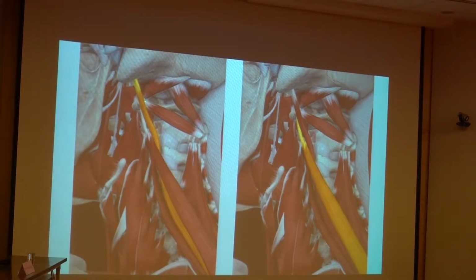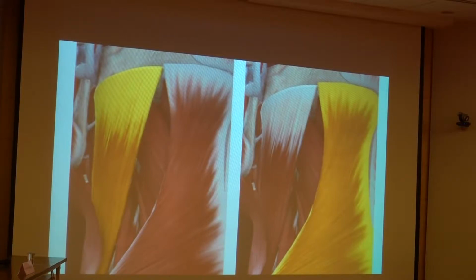So when you scan the long axis of your obliquus capitis inferior, you're going to see on top of it your longissimus capitis. And also when you're scanning the C2-3 facet, you're going to see that the splenius capitis is really covering that, on top of the third occipital nerve. So that's the muscle we frequently forget. In fact, you're seeing it when you're trying to do the intervention on the third occipital nerve or the C2-3 facet. You are doing the injection all the way through that muscle, and that muscle is not small, it's big as well. And then also another landmark, you probably see it, but you don't know it. It's the most superficial layer of the muscle, the upper trapezius, very thin over the suboccipital area. And also the SCM, also very thin.